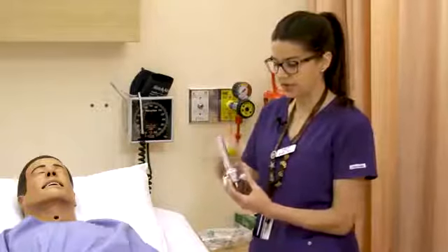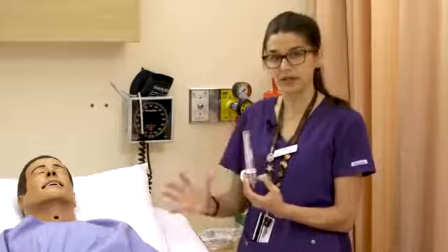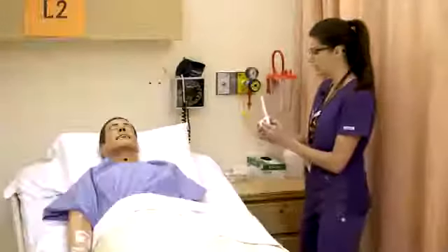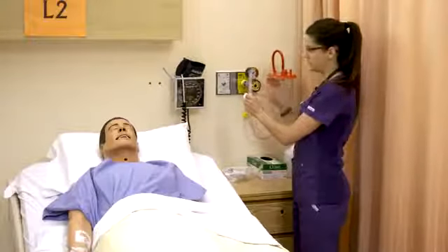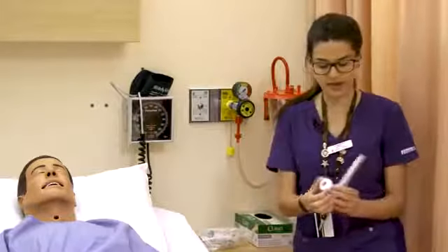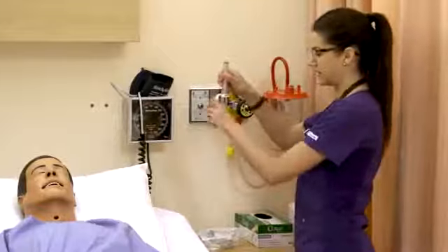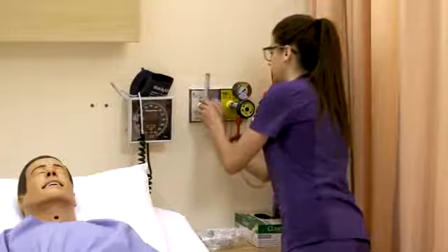Using this flow meter, we know how many liters per minute a patient is getting, and depending on the amount or the FiO2 delivery that they need based on their situation, we would set this device. This flow meter goes into the wall, and it makes a bit of a pressure sound. You attach this white piece onto the screws in the wall, and it'll give a bit of a pushback. So you have to make sure that it's exactly perpendicular, and then you can screw it on. I'll just do that now, and it'll give that spray sound.